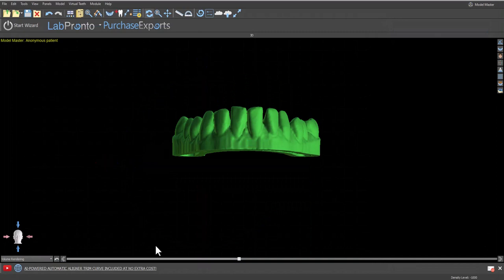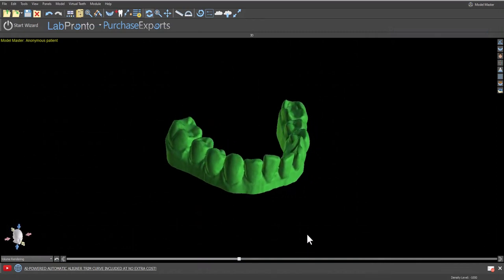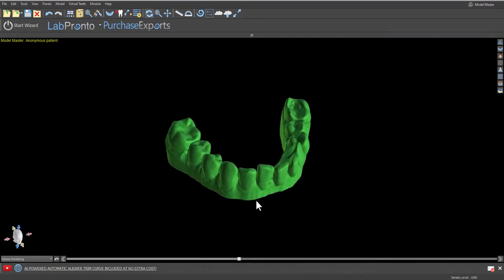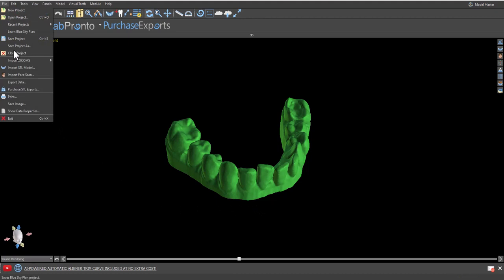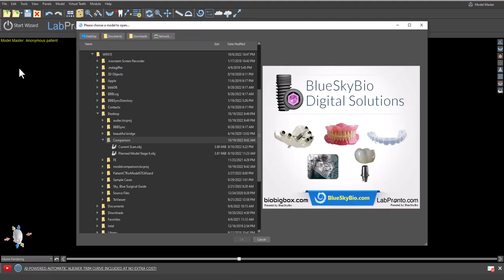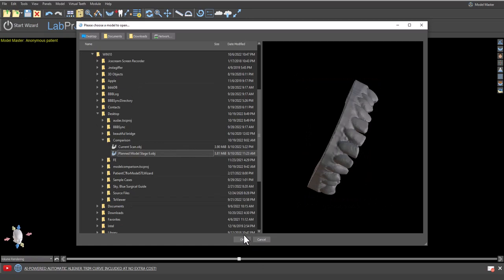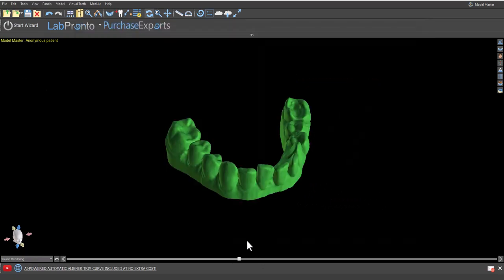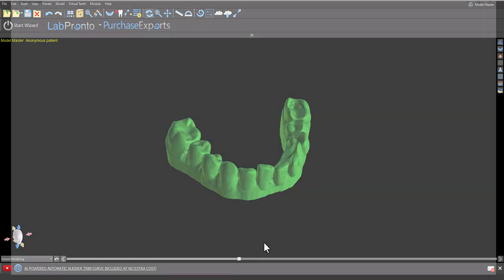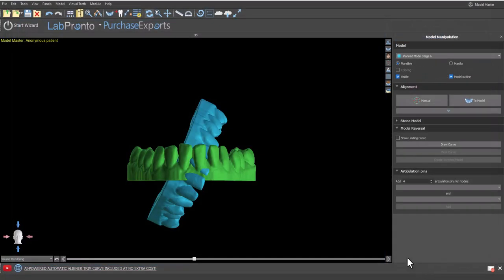We've now imported a model corresponding to the patient's actual anatomy. We're going to proceed by importing the digital model from the plan at the corresponding stage by clicking file import STL model, selecting the relevant model and clicking ok.